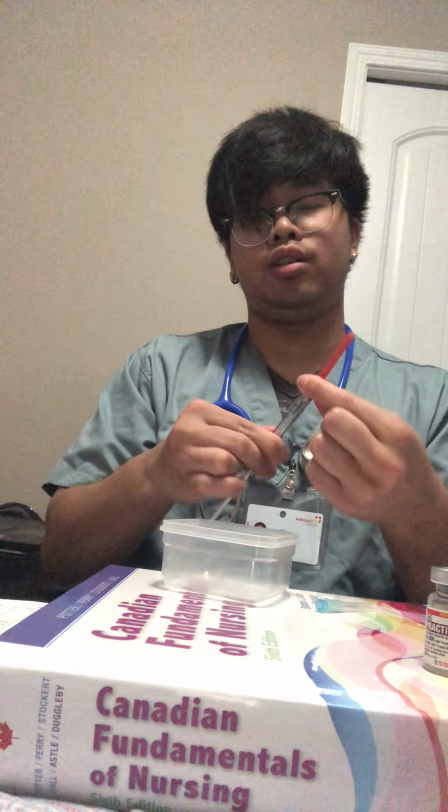Okay, we won't be needing this blunt fill needle anymore, so we can take it off, put it in the sharps container, and switch to a 25 or 27 gauge needle.